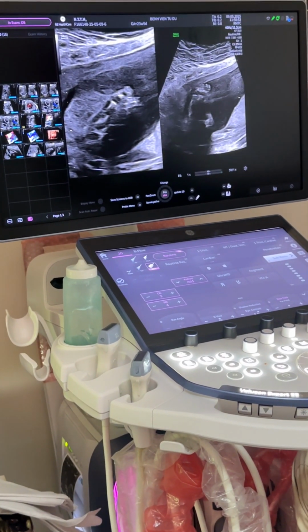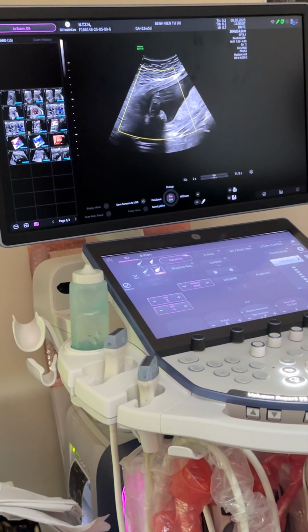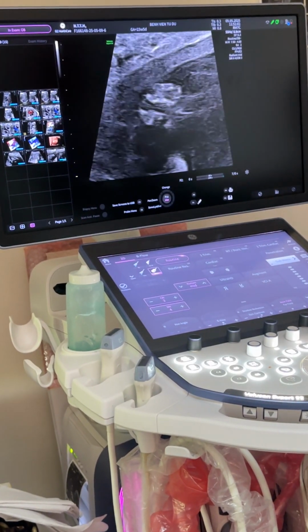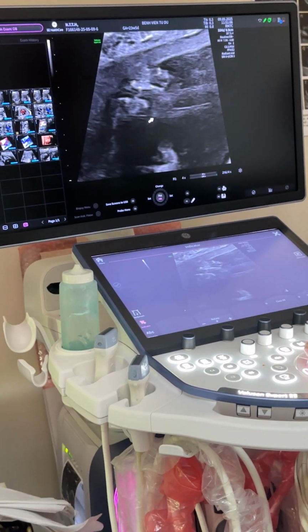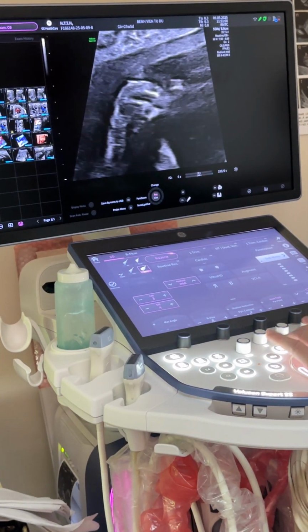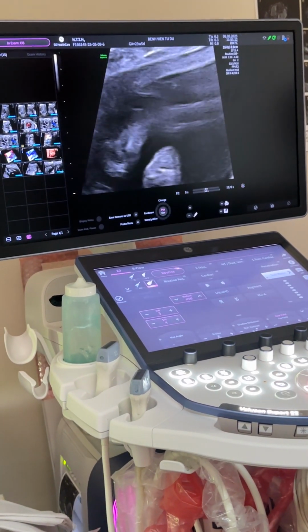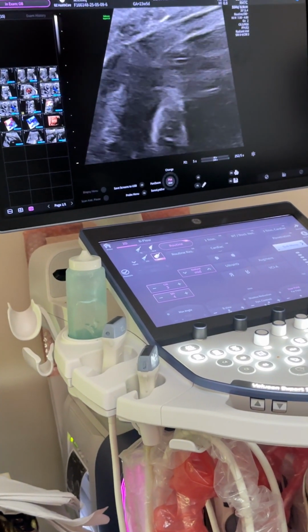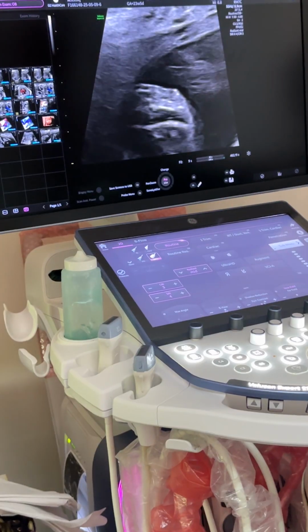It's hard to exclude syndactyly on the toes. It's much easier to show syndactyly on the hands. But if you look at the second and third digit on the foot, you have to ask, is there syndactyly of these two digits? That's frustrating. So if you look at these two digits, you see the second and third toe, just check that there's no signs of syndactyly, but it can be very, very challenging.